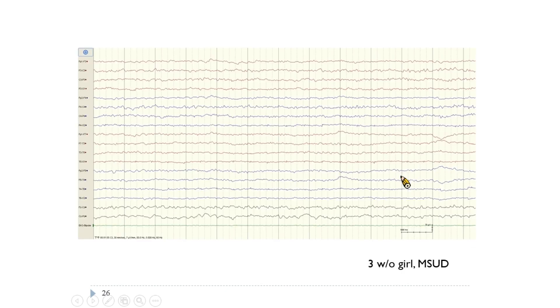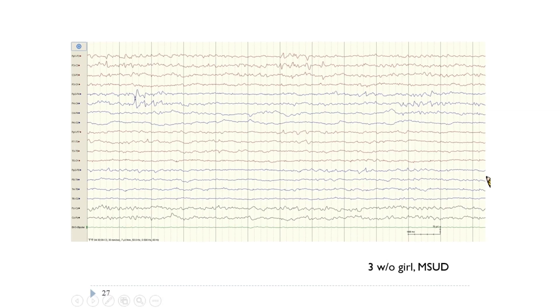A full-term three-week-old girl diagnosed with maple syrup urine disease having seizures. This EEG shows a normal continuous background activity, but there are spikes over bilateral frontal areas — unlike normal transients, there are too many to be regarded as normal.